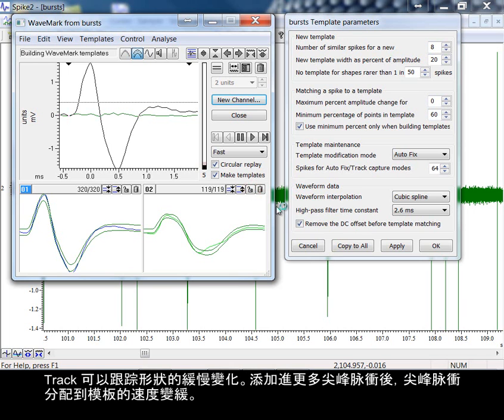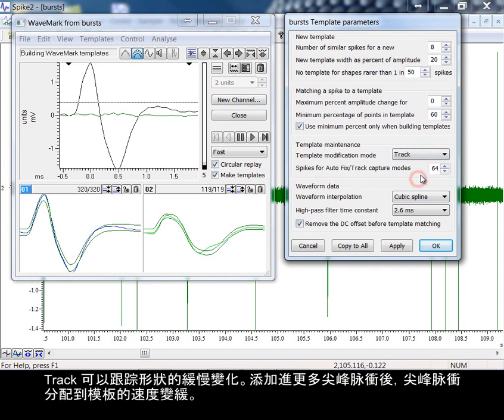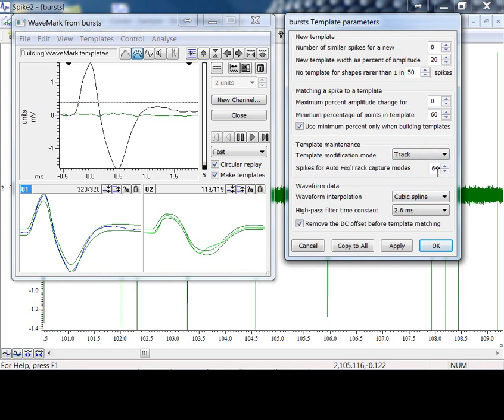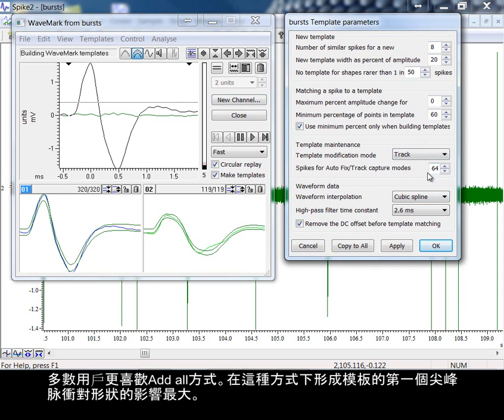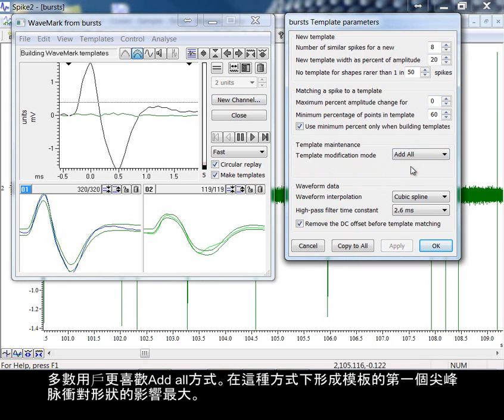Track follows slow shape changes. The contribution of each spike to the template decays as more spikes are added. Most users prefer add all. In this mode, the first spike that forms the template has the most influence on the shape.